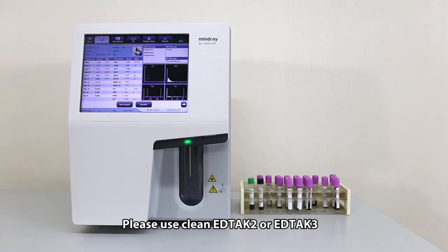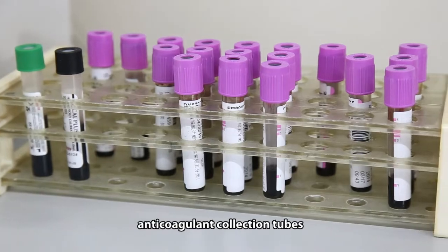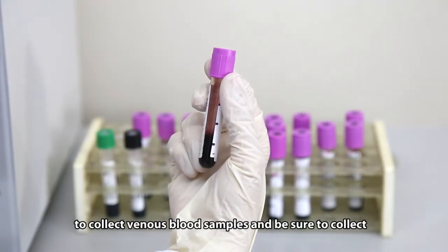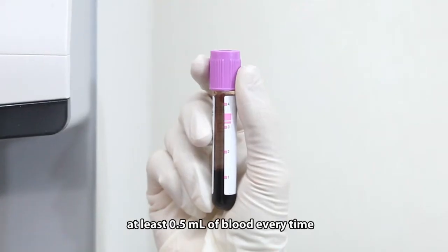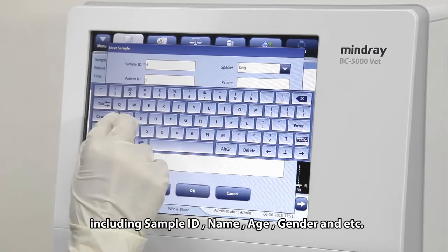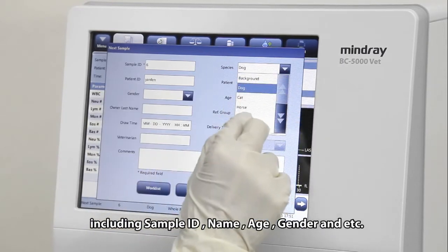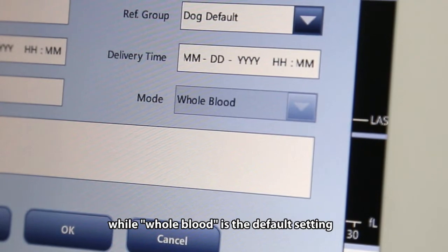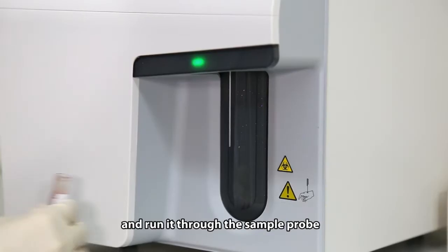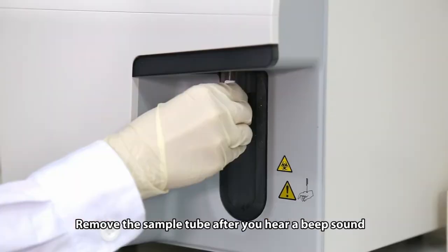Please use clean EDTA K2 or EDTA K3 anticoagulant collection tubes to collect venous blood samples, and be sure to collect at least 0.5 milliliters of blood every time. You may enter the patient information including sample ID, name, age, gender, and more, while whole blood is the default setting. Mix the sample well and run it through the sample probe. Remove the sample tube after you hear a beep sound.